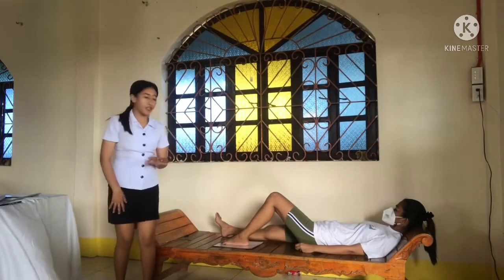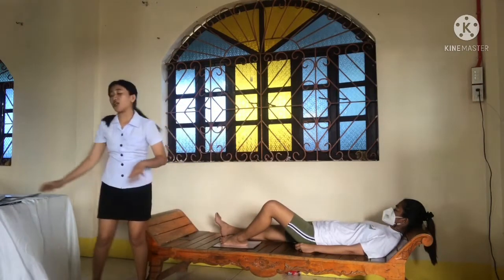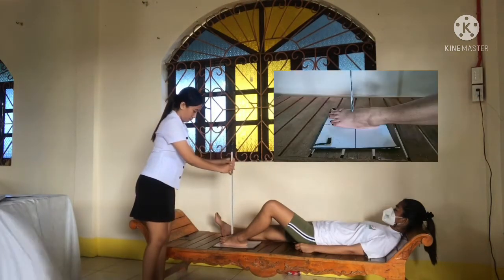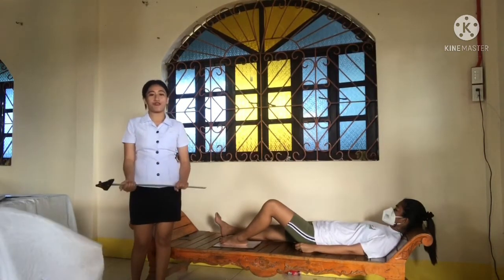Rotate the leg laterally an angle of 30 degrees. So, the central ray is perpendicular to the base of the third metatarsal. So, this shows the interspaces between the first and second metatarsal and between the medial and the intermediate cuneiforms.